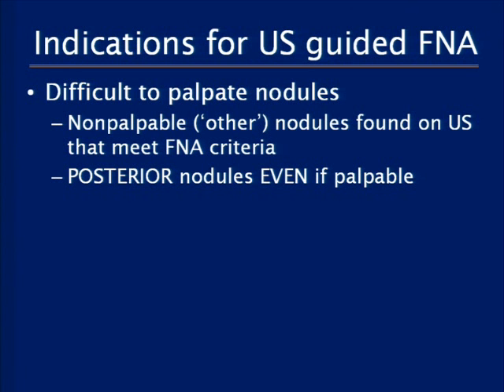So if the nodule's very difficult to palpate, it's really hard to biopsy it by palpation, obviously. So things that are very posterior and things like that, nodules that are seen on ultrasound and not clearly palpable, would really require ultrasound for that biopsy.